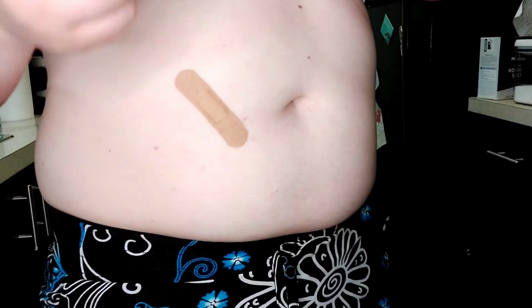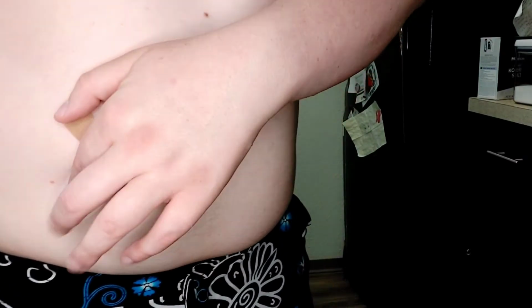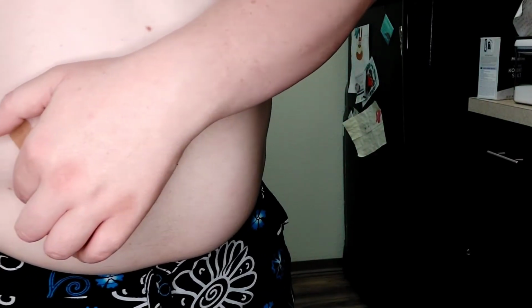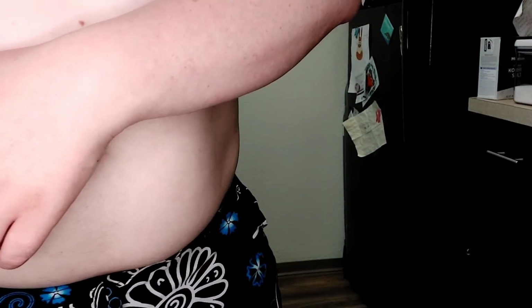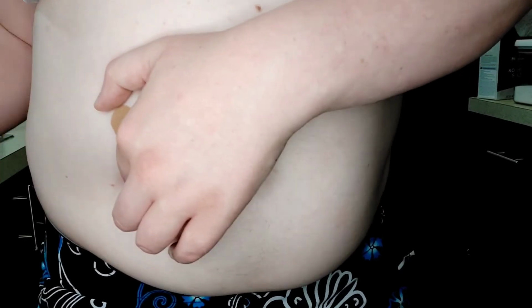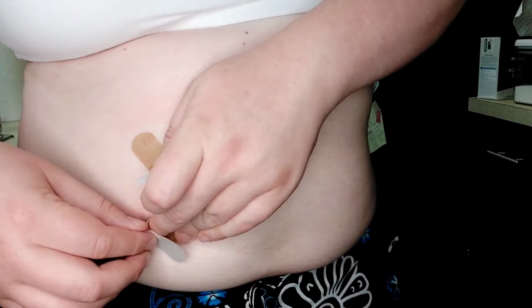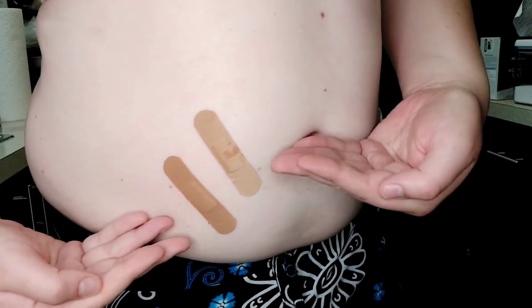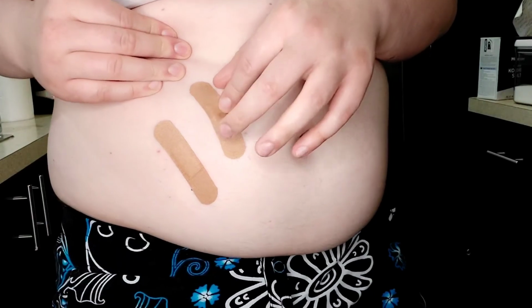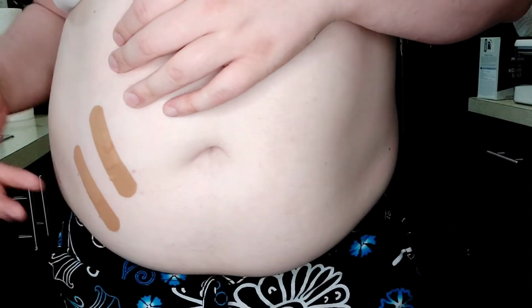Now, one thing to note about the smaller needles is that they will have more resistance to being plunged in, but that's just physics, right? Trying to push pressurized fluid through a smaller tube is going to be harder than a bigger tube. So you'll just need to inject slowly and steadily, and make sure that you get it all in. Obviously, injecting twice is not ideal, but that's really okay. It's not the end of the world. If you mess up an injection, you're not gonna die.